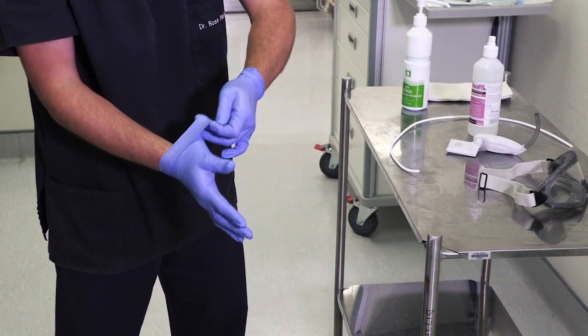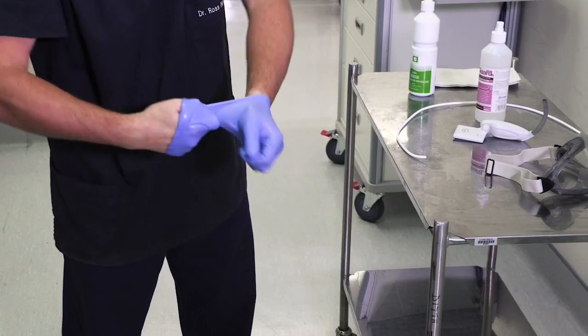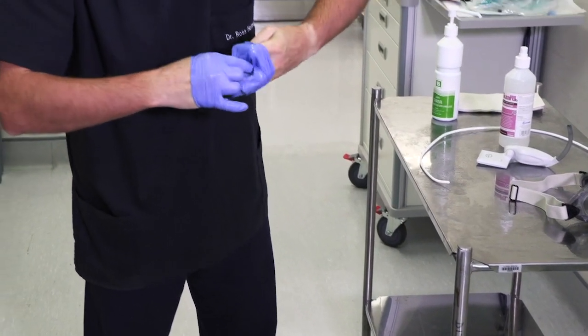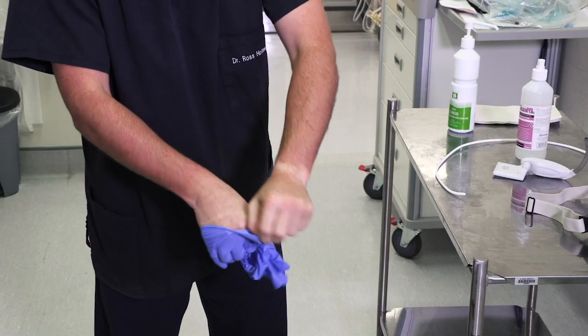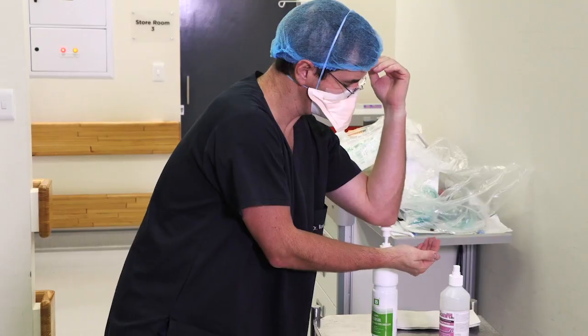Pinch. Cover. Pull. Pull. Disinfect your hands.